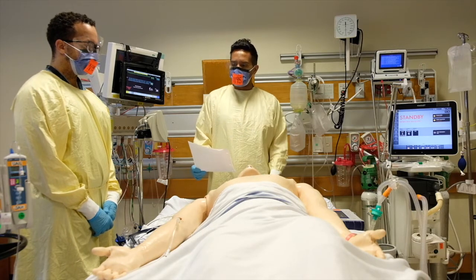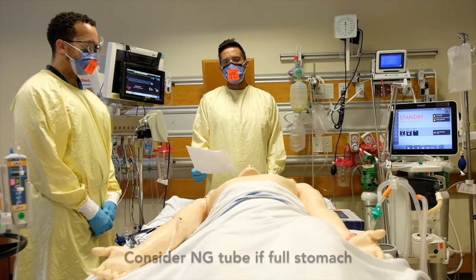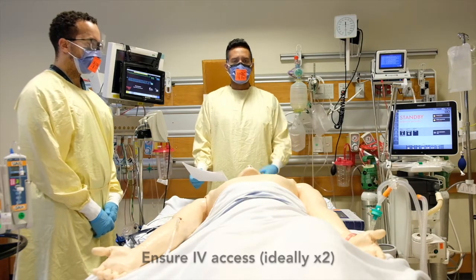The patient is already on pre-intubation fluid bolus as well as vasopressors. This patient does not need a pre-intubation NG because he has not eaten recently, and we have 2 IVs that are in place.